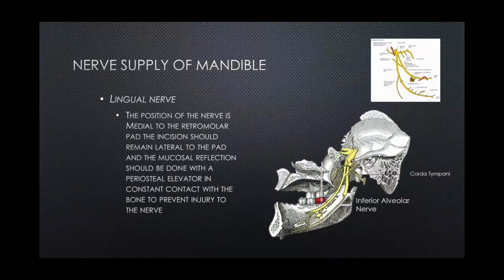And the big thing here is that most of the time, the lingual nerve will lie away from the mandibular teeth. But there is a small percentage of people where that lingual nerve can ride pretty high up on the lingual surface of the mandible, and more specifically distal to that second molar. Sometimes it could lie right adjacent to that lingual bony tissue. So be very, very careful whenever you're reflecting a flap distal to the second molar, because we always expect the unexpected, that maybe that nerve is there.